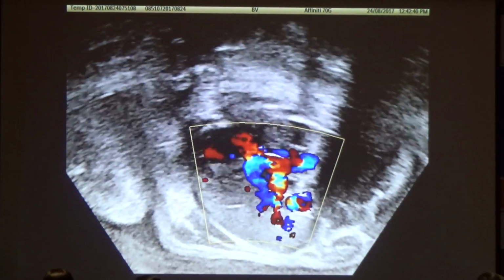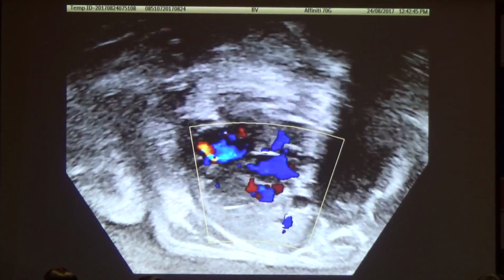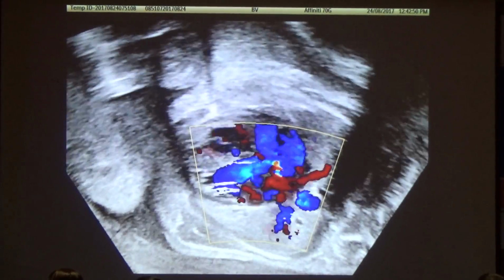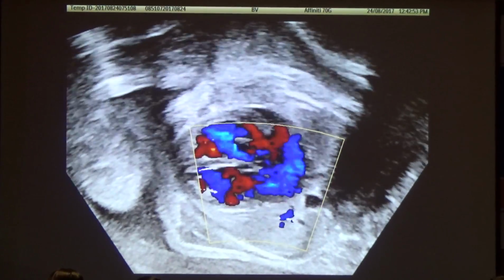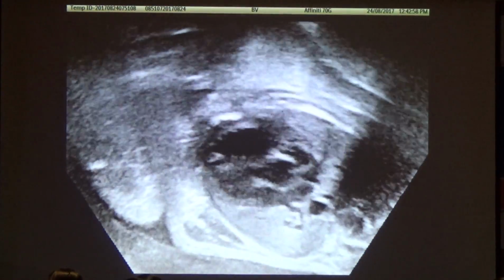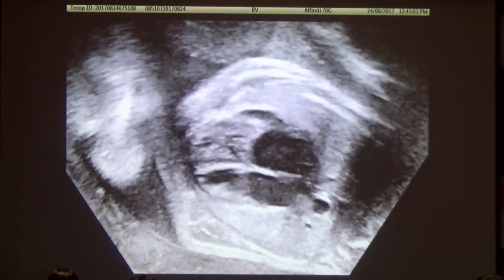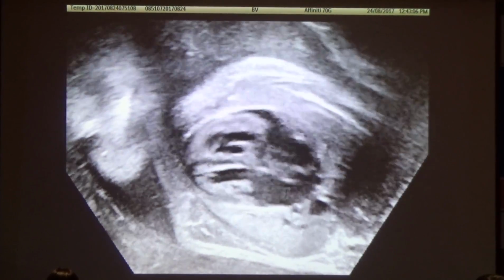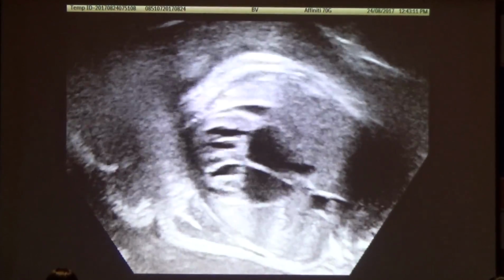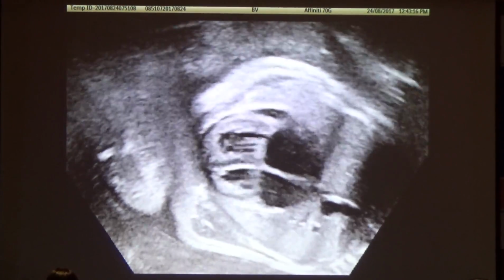Okay, so if there was a left-to-right ductus shunt on the duct Doppler, we should be able to see it, eh? I don't see it there yet. Okay, so the Doppler looks fine to me. Okay, can you take color off for a second? That's better. Okay, see that just one, it's like a cello. I'm gooping up your machine, eh?